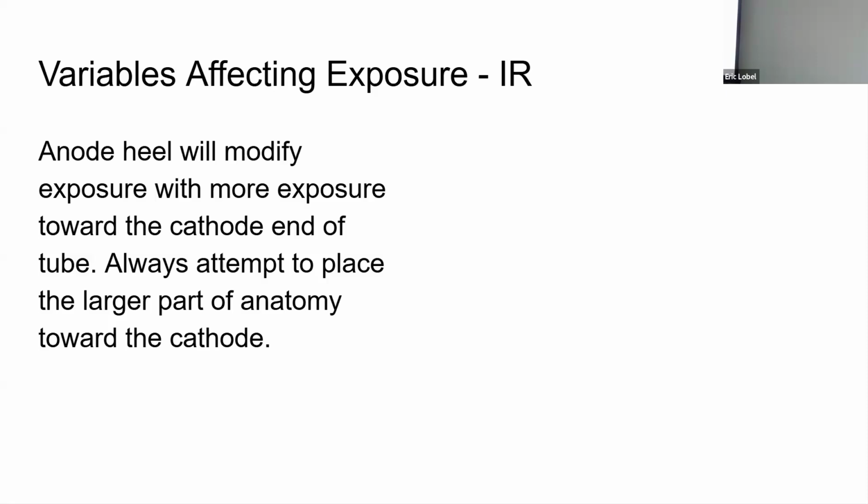The tubes, interestingly enough, haven't changed that much for years. CAT scan tubes are a little bit different, right? They're made for more heat.